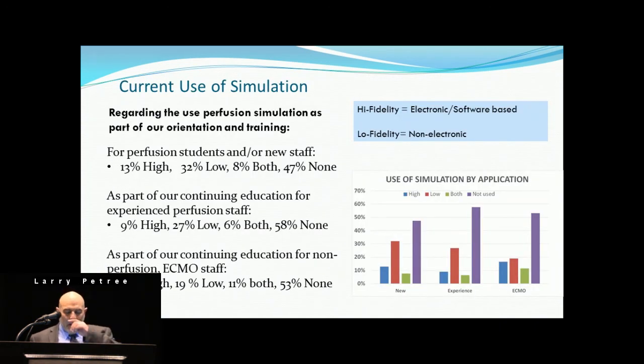There's a lot of information on this slide, so we'll try to go through it kind of slowly. The question was regarding the use of perfusion simulation as a part of our orientation and training, and I wanted to understand how it was being used. So for perfusion students or for new staff, 47% do not use simulation at all. Only 13% used high simulation, and 32% used low.